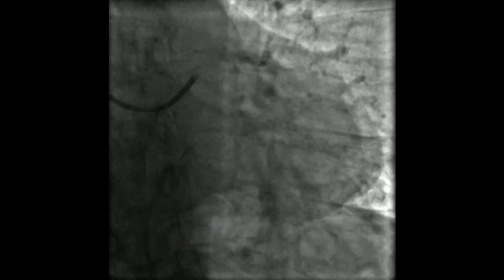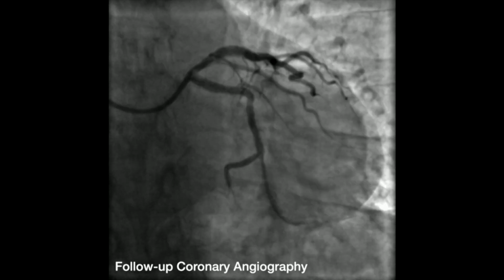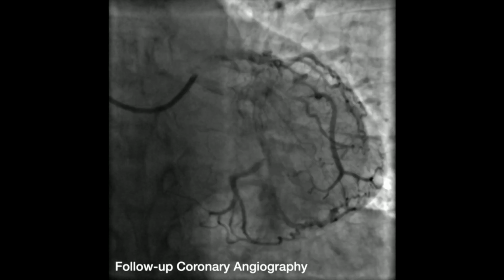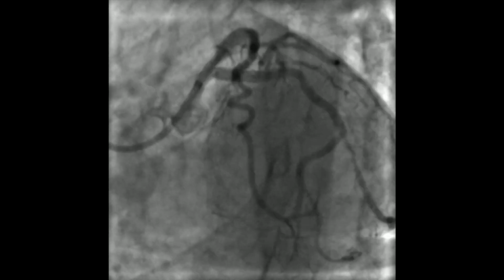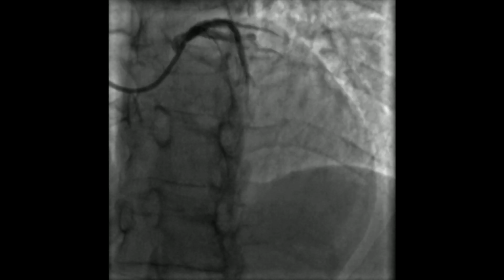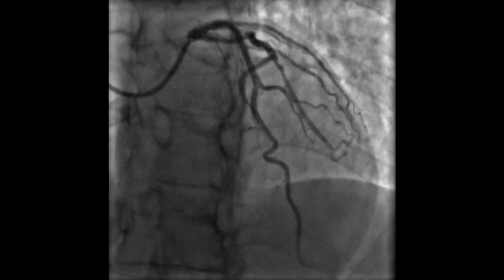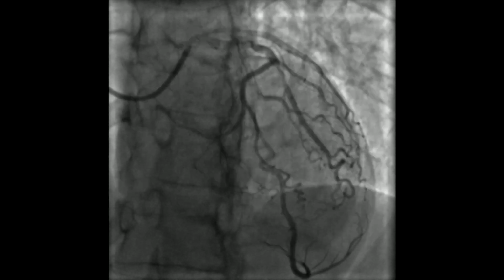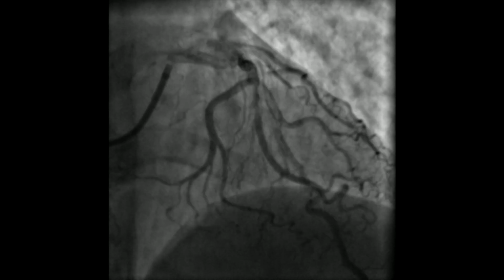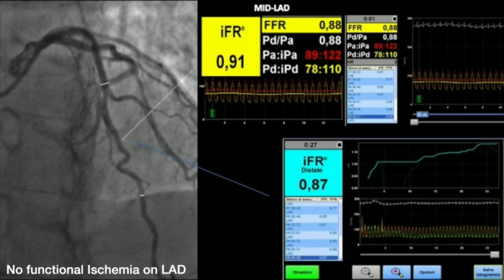She came in our outpatient clinic. You see that there is a progression on the marginal branch, but the LAD is not only patent, but looks widely open, with the calcium sitting there still, but with large lumen on the LAD, and no impairment of the flow or new stenosis on the side branches, the first and the second diagonal, the one which is pinched in the stent, the second one was spared because we stopped with the stent before.